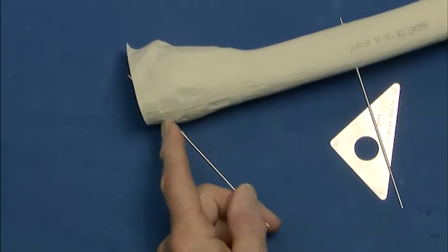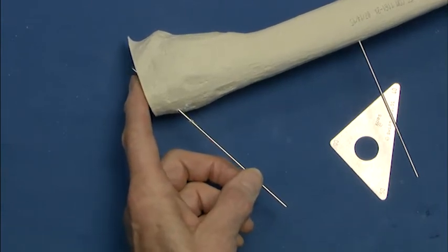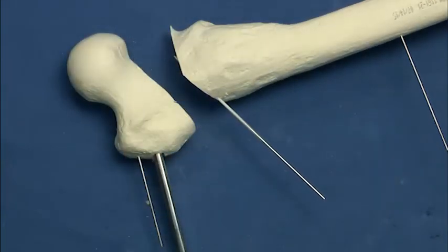And I've also placed this so that I can use it. I want a smaller closing wedge. Our plan showed that we were only going to go approximately halfway across the transverse osteotomy for the correction. So now we've done the transverse osteotomy and we've done the horizontal plane correction compensated closing wedge.